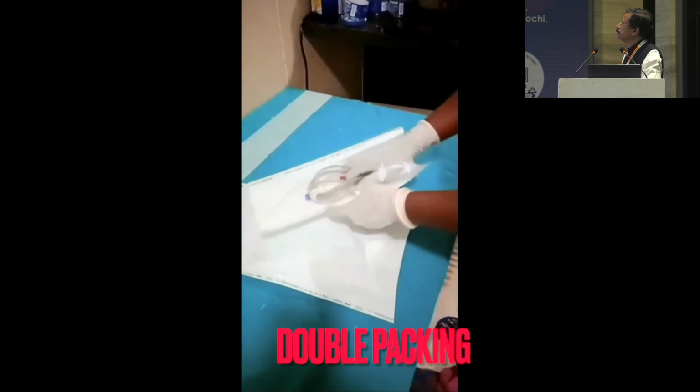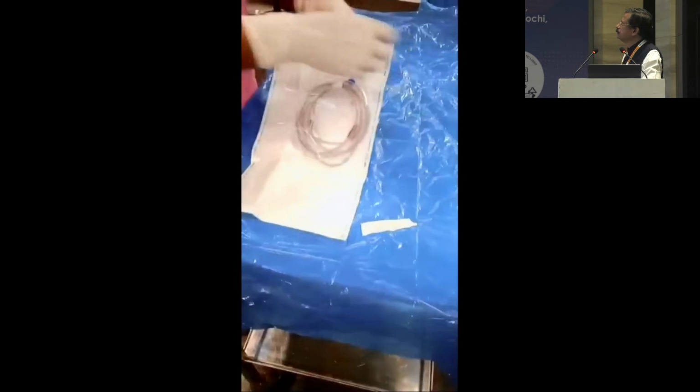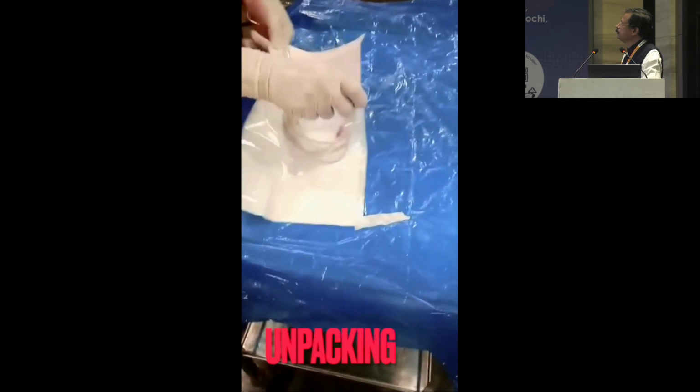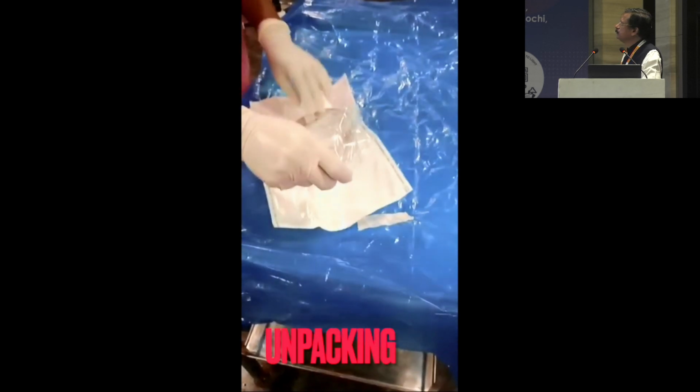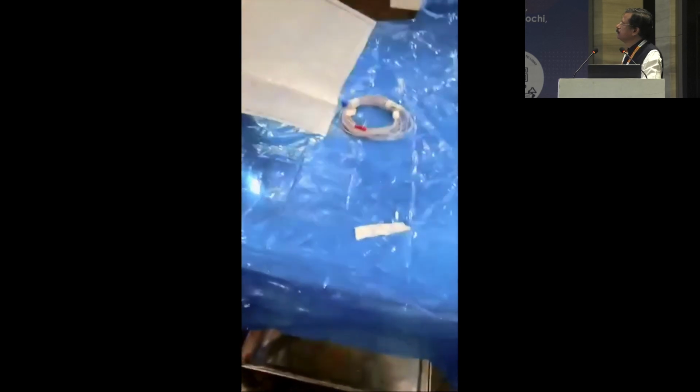Then it is placed in a pouch. The sterilization is usually done by ETO because you have applied the sticker. When you are opening it, the tubings won't fall in the unsterile area, and also it will ensure not to damage the cutter.